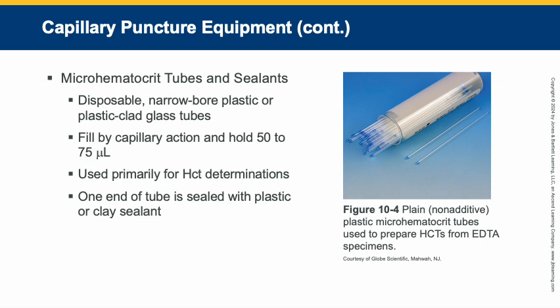Heparin tubes typically have a red or green band on one end. Non-additive tubes have a blue band. Smaller microhematocrit tubes designed for use with special microcentrifuges, such as those available from StatSpin, require as little as 9 microliters of blood, and those are what are used on infants and children, like anemia screening programs.